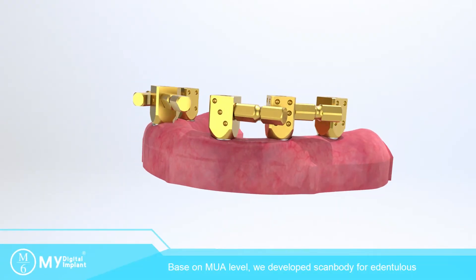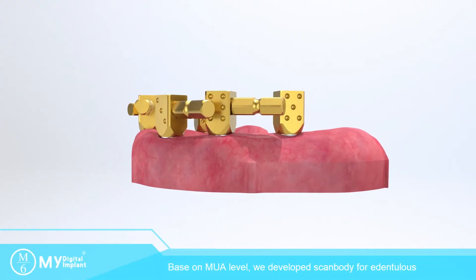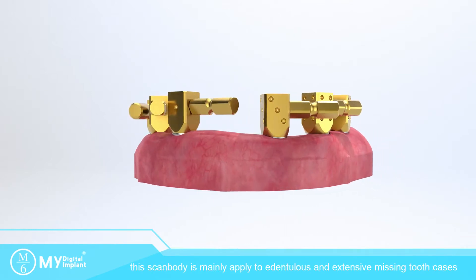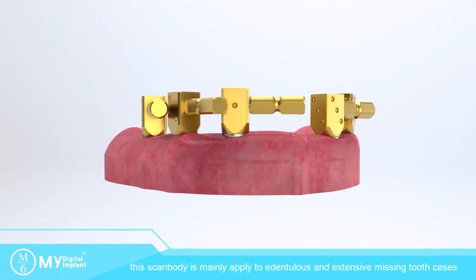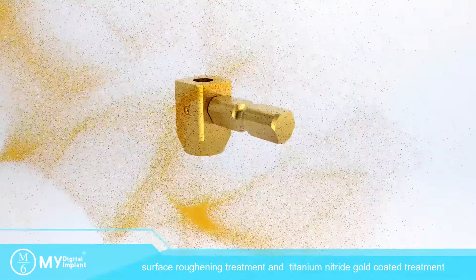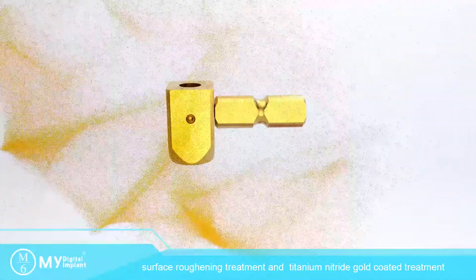Based on multi-unit abutment level, we developed scanbody for edentulous. This scanbody is mainly applied to edentulous and extensive missing tooth cases. Made by medical grade 5 titanium material, with surface roughening treatment and titanium nitride gold-coated treatment.